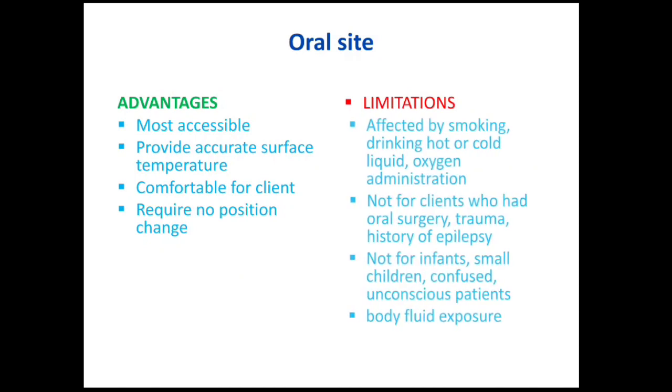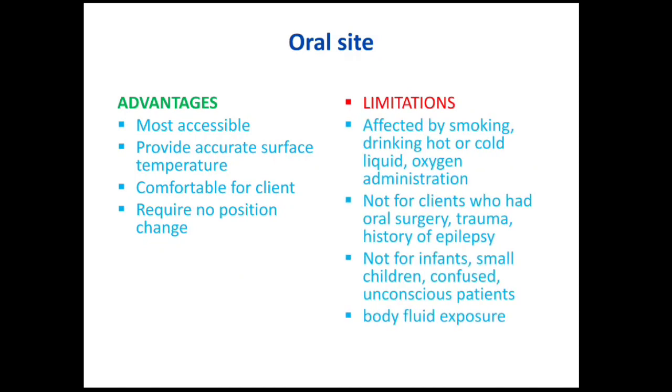But it has certain limitations because it is affected by smoking, drinking hot or cold liquids, and oxygen administration. Also, we cannot use this method of assessing the temperature in patients with oral surgery or trauma or a history of epilepsy. We cannot use this method for infants, small children, and confused or unconscious patients because of the chance of biting the thermometer. And another limitation is body fluid exposure.